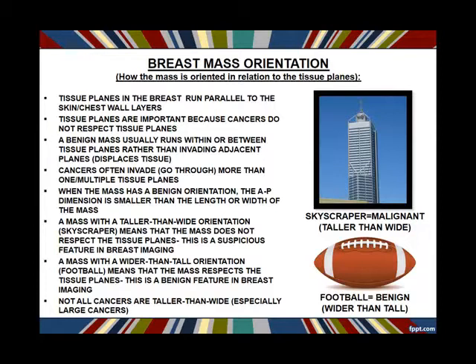The exception is when masses get gigantic in the breast. If a mass is taller than wide but huge, it runs out of room to grow vertically — it runs into the skin line or the chest wall layer — so the only way to expand is outward. So big cancers often are wider than tall because they've run out of room to grow vertically. Another way of talking about these terms: taller than wide is also called 'vertical,' and sometimes radiologists will ask if the mass is vertical or horizontal.